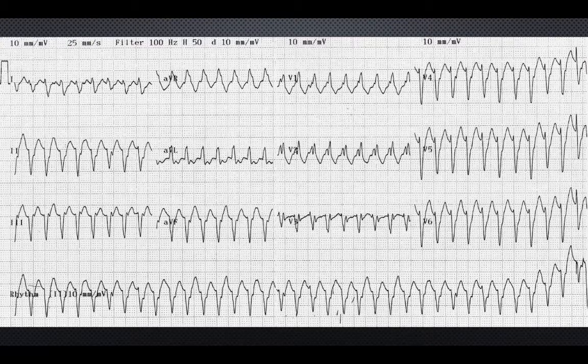Arrhythmias are not uncommon in patients with LVADs, including atrial fibrillation and ventricular arrhythmias. Electrolytes and troponin should be evaluated in any patient with an arrhythmia. Treatment of AFib is the same as in patients without LVADs. Ventricular arrhythmias are treated with volume resuscitation and possibly pharmacologic or electrical cardioversion. If electrical cardioversion is deemed necessary, the patch should be placed in the anterior-posterior position. A lot of patients with LVADs also have ICDs in place. They can possibly present with improper firing of their ICDs from LVAD interference.